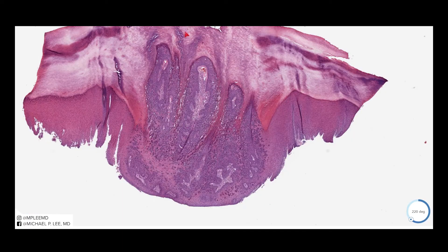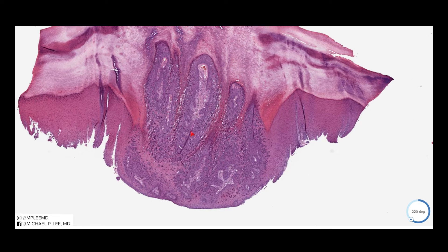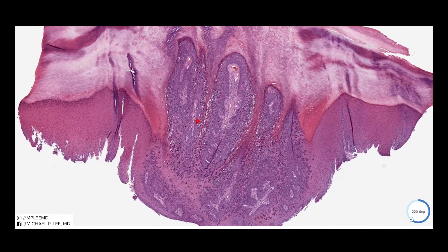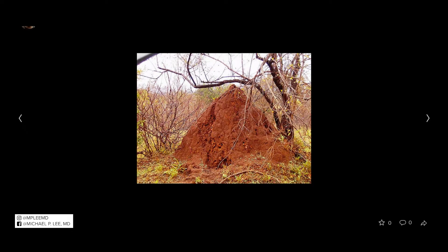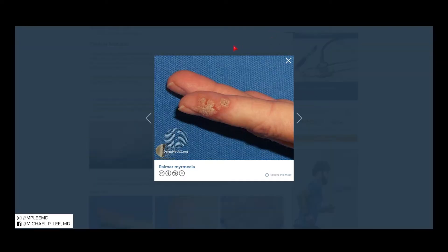Myrmecia is a viral wart that's commonly found on the hands and the feet, or acral. Sometimes we call it a palmoplantar wart, and the reason they're called myrmecia is because of the clinical appearance of it looking like an anthill. This is an anthill — probably the largest anthill in recorded history — and you can see clinically it has this sort of mounded appearance with multiple little warts here.